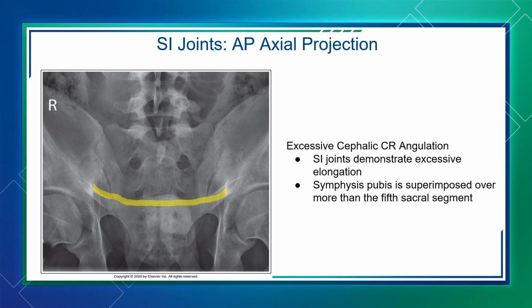When this does occur and the student is able to accomplish a successful repeat image, you can count this as an additional image because this is patient anatomic variance, not the student's fault. They utilized the appropriate central ray. However, it was just too much for that patient.